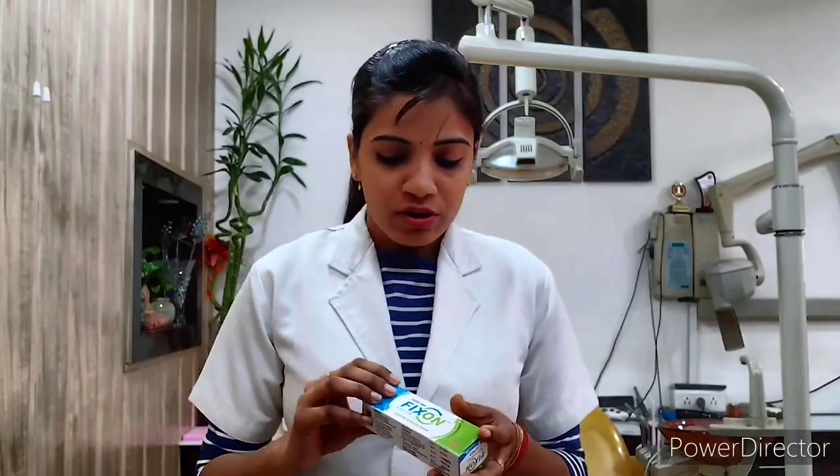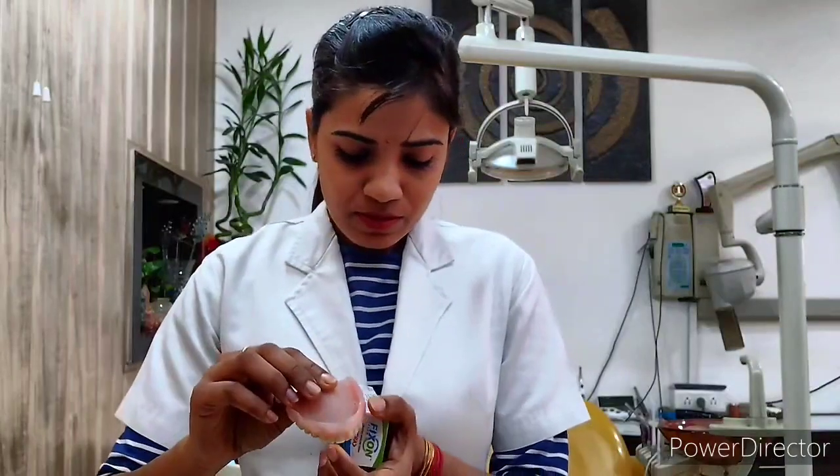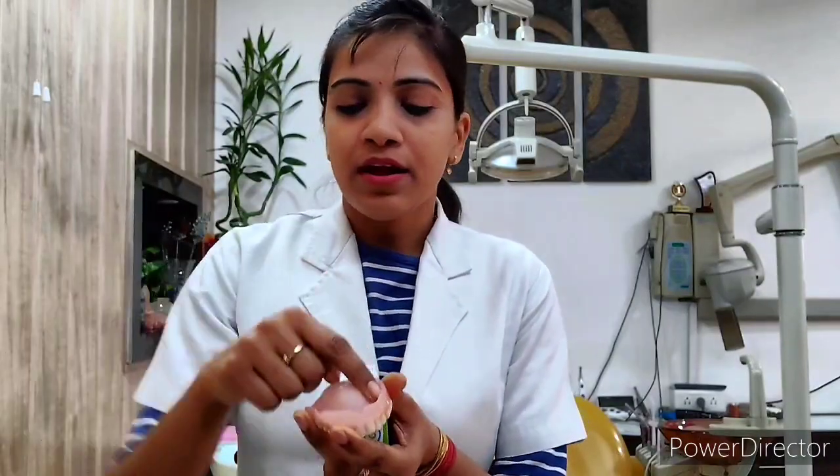So this is a highly viscous solution to improve the retention of the complete denture. This is our denture — upper and lower. For applying, we place three dots: one here, one here, and one here, and then we put it in the mouth of the patient.